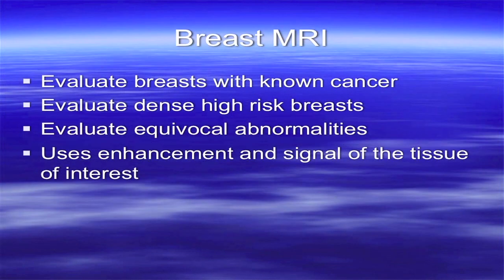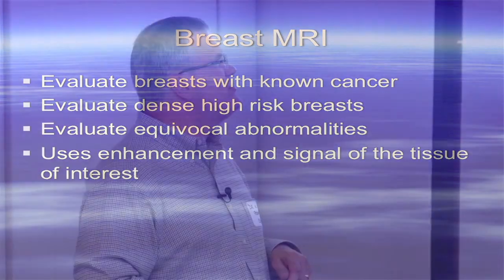And breast MRI, we talked about. I'll show you just a couple images real quick. Breast MRI is often used as a problem solver. Oftentimes, breast surgeons will get a breast MRI before they do a lumpectomy or mastectomy to make sure there's not something else in the breast, because the patient has high risk factors for having something else at the same time. And so they'll get a breast MRI.